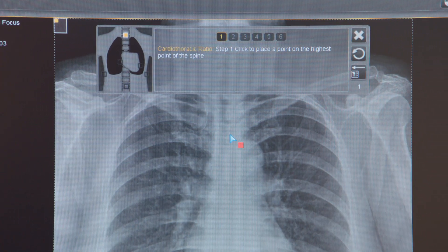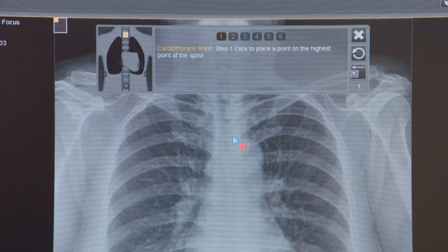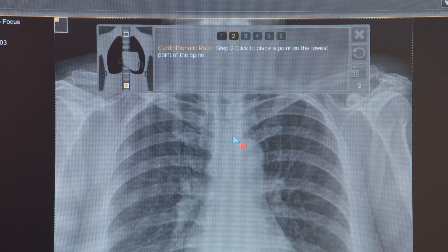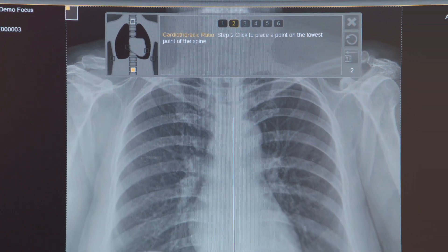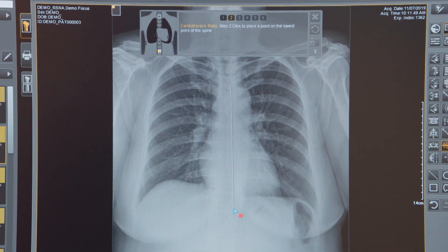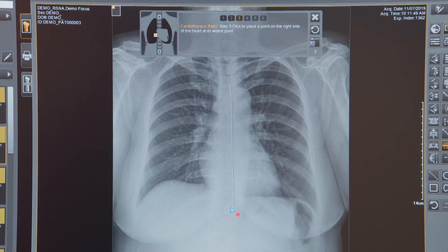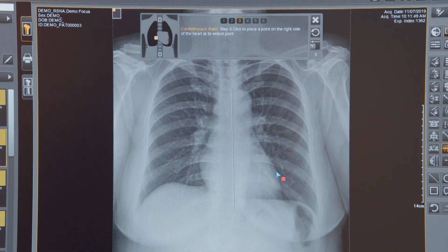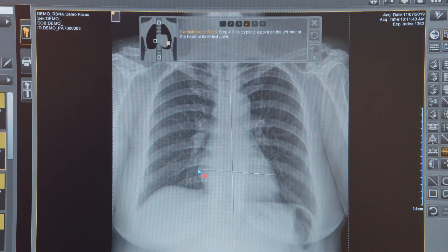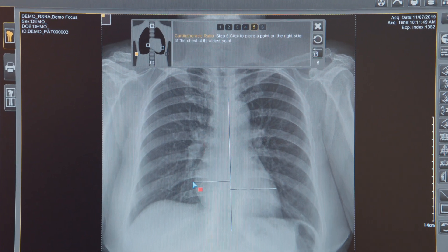First you want to select the highest position on the spine of the heart, and then the lowest position. Then we're going to click a point on the right side of the heart and then a point on the widest part of the left side of the heart.